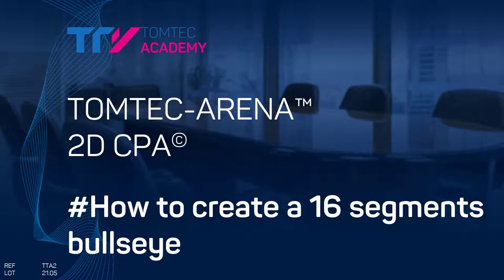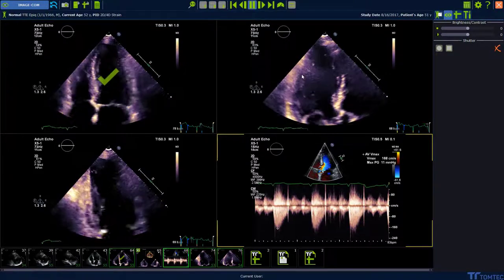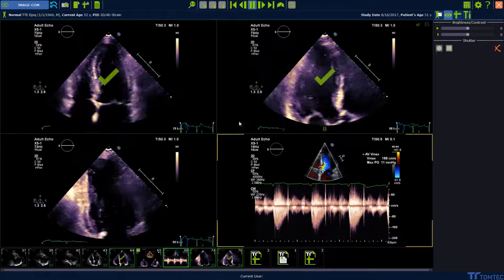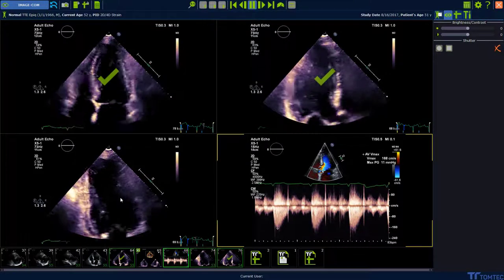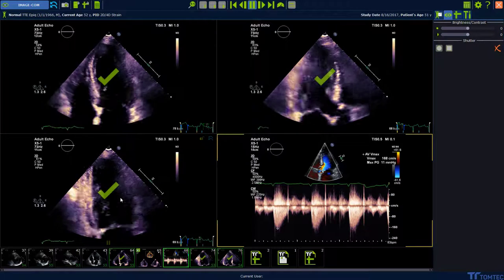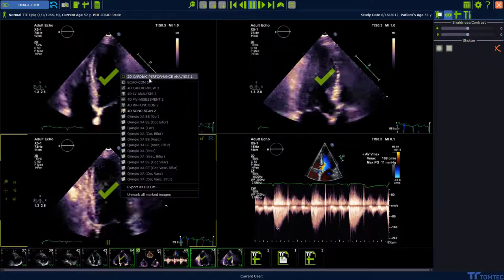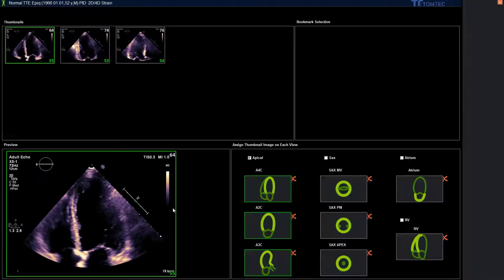How to create a 16-segment bullseye in 2D CPA. To create 16 segments, we need three planes from the long axis or the short axis. Pre-select using CTRL and left mouse click, then right mouse click to launch the application.